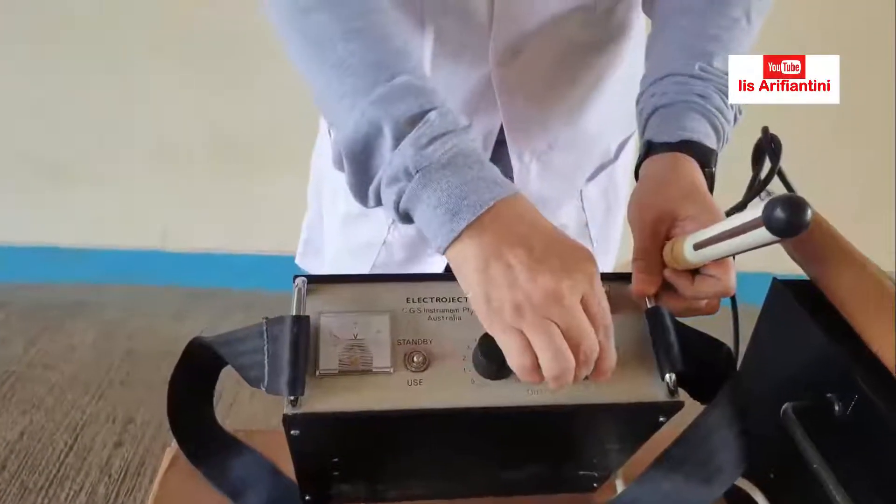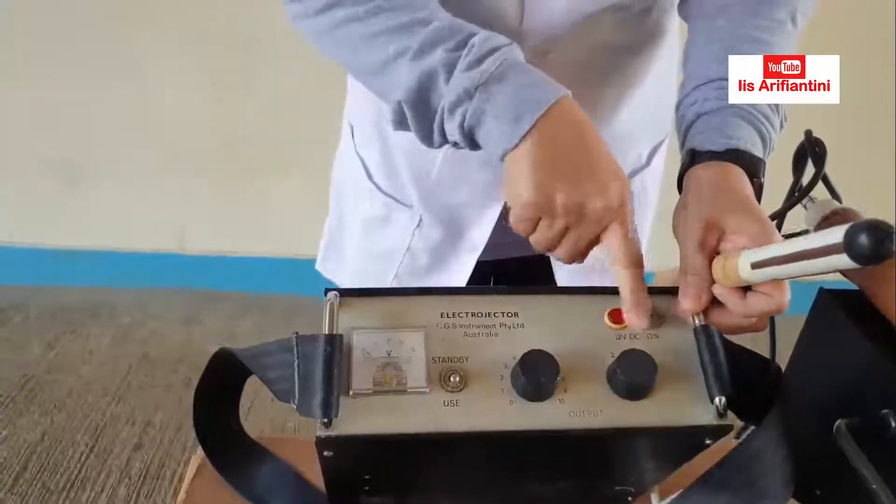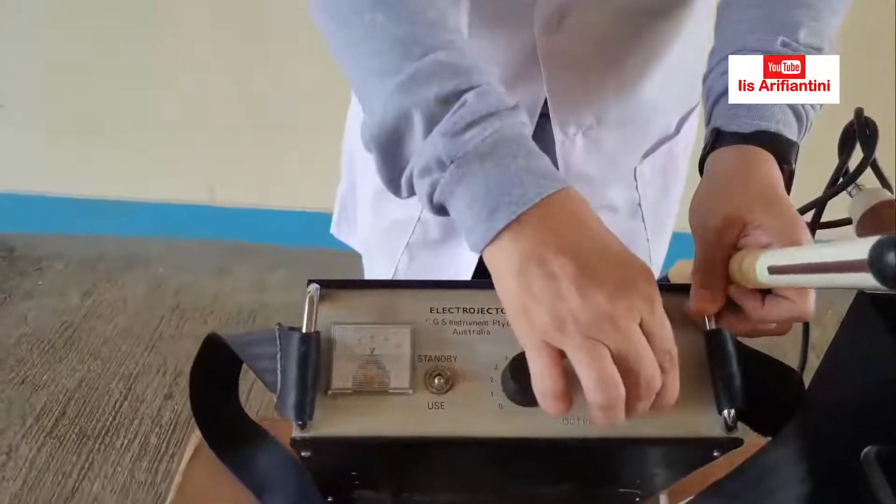Ada pilihan lain — ini adalah elektro ejakulator yang bentuknya lebih kecil, menggunakan aki atau baterai (DC). Ini juga sama, bisa menggunakan probe kecil untuk rusa atau harimau. Ada on-off-nya, kemudian ada untuk menaikkan rangsangannya — ini untuk meninggikan voltasenya, setiap 5 detik dinaikkan lagi.